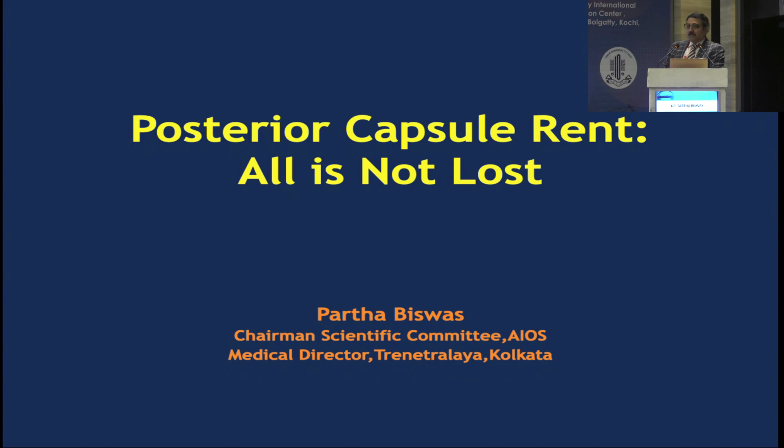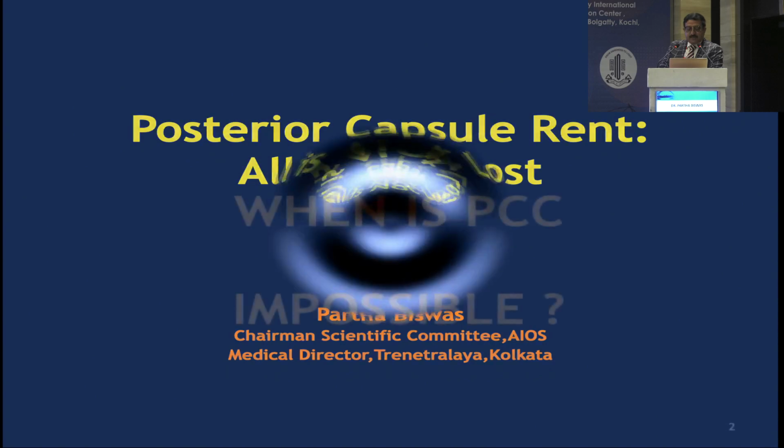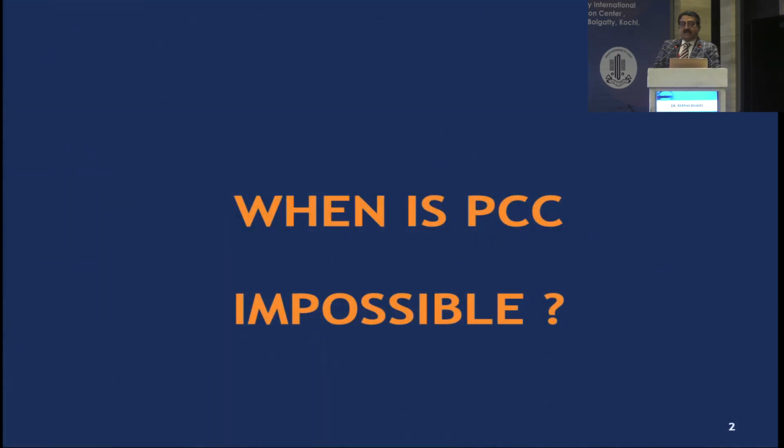However, this is a course that goes on, and Dr. Mathur's course is full of wonderful tips, and we learn from each other through these tips. PCR is something that, when it happens, leaves us asking what we do.